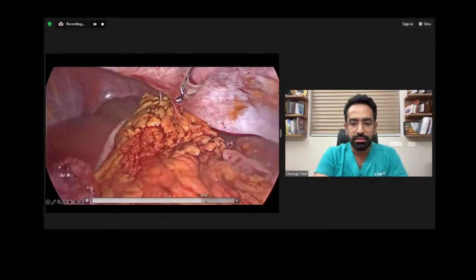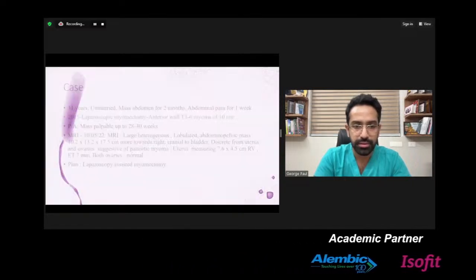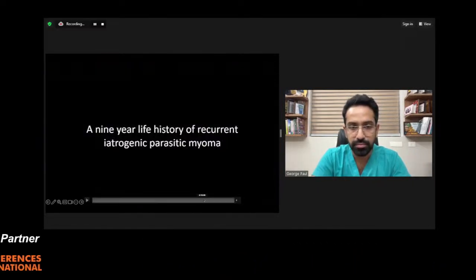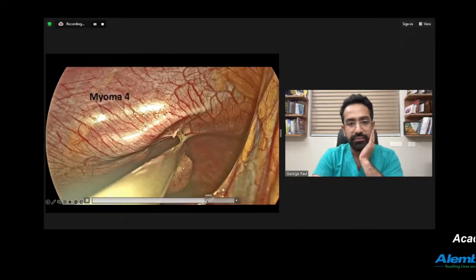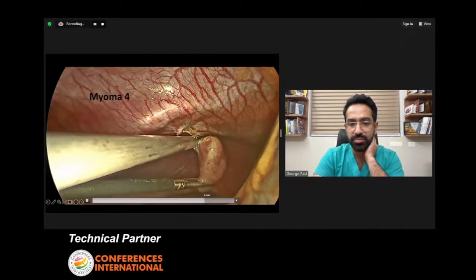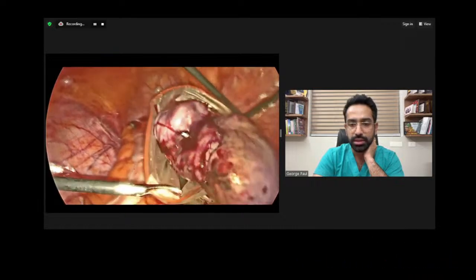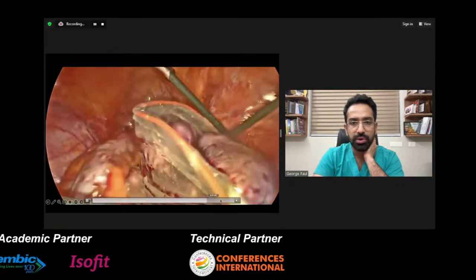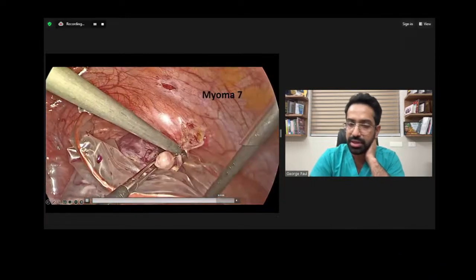And that's the fourth myoma. We got it just above the liver. Again, other smaller ones. In total, about 7 myomas were taken, and then it was morcellated in the bag.